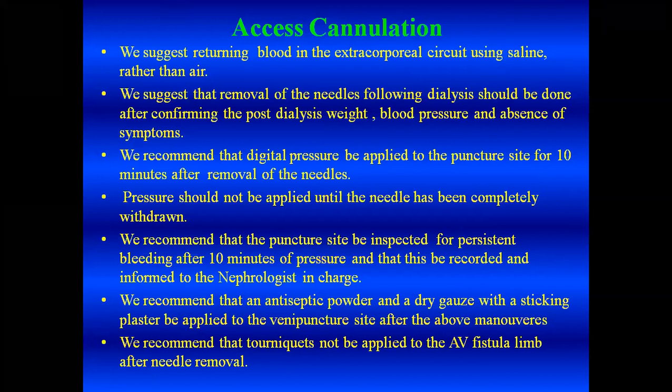In addition, when air enters a dialyzer, especially if you are going to reuse dialyzers and fill them with disinfectant, incomplete filling of the dialyzer with the disinfectant might occur if there are a large number of air bubbles. So use saline rather than air to return blood. It's generally not a problem if you know the volume of the extracorporeal circuit.